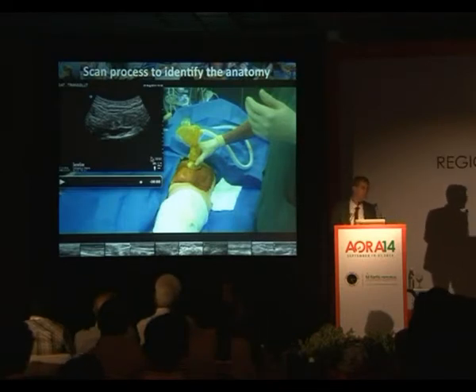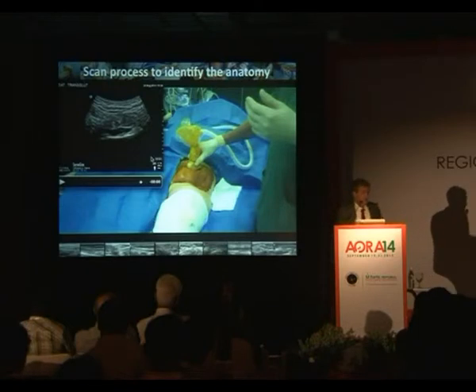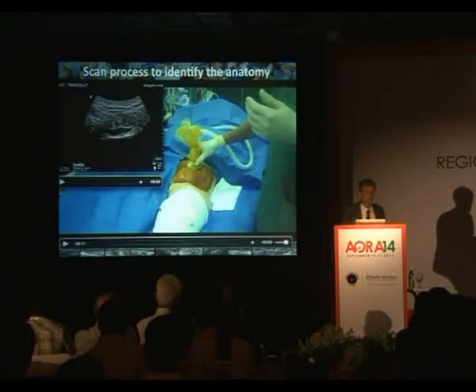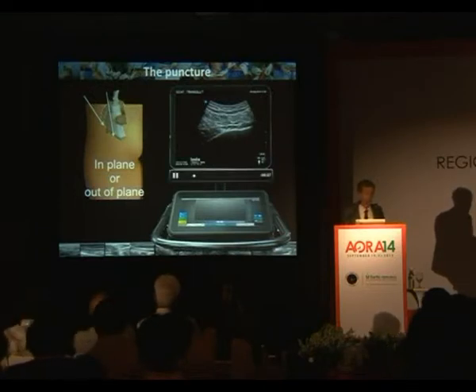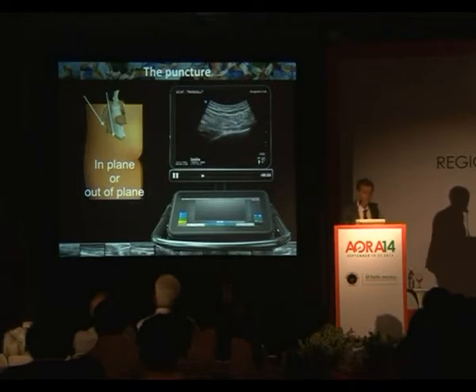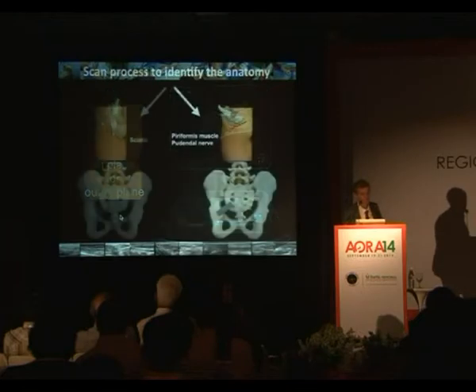I'm living today in a country where the average BMI is like that, and we are performing this block on very fat patients, and it's quite easy. So we can do the puncture in plane or out of plane. This is an in plane technique, sorry. The out of plane technique will be the same. It has to be close to the probe to go directly on the bone contact, to be safe.